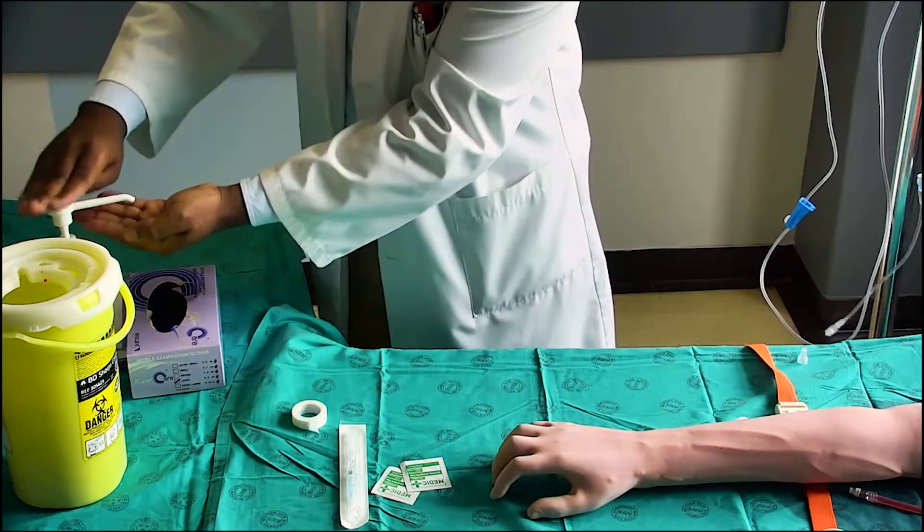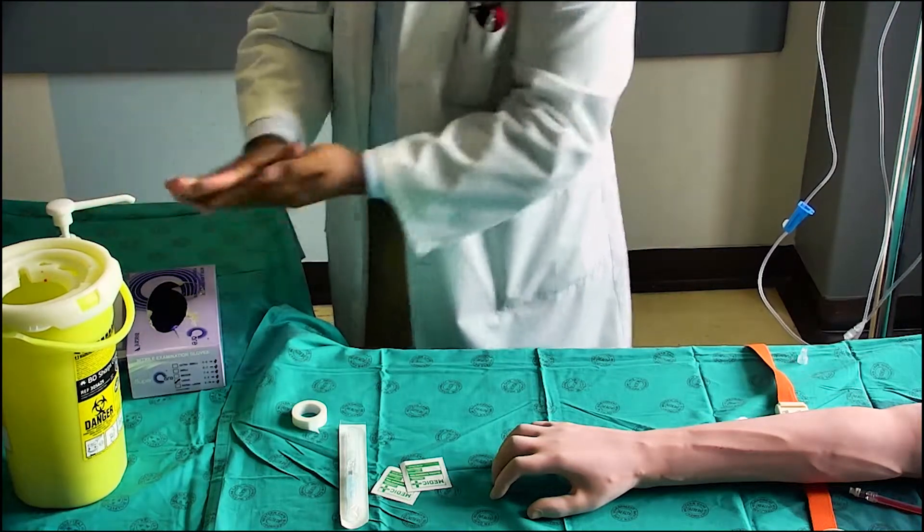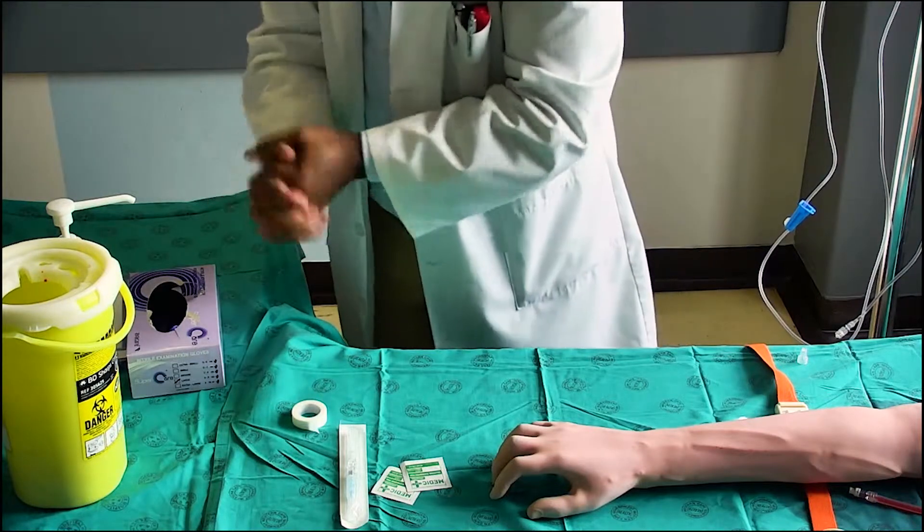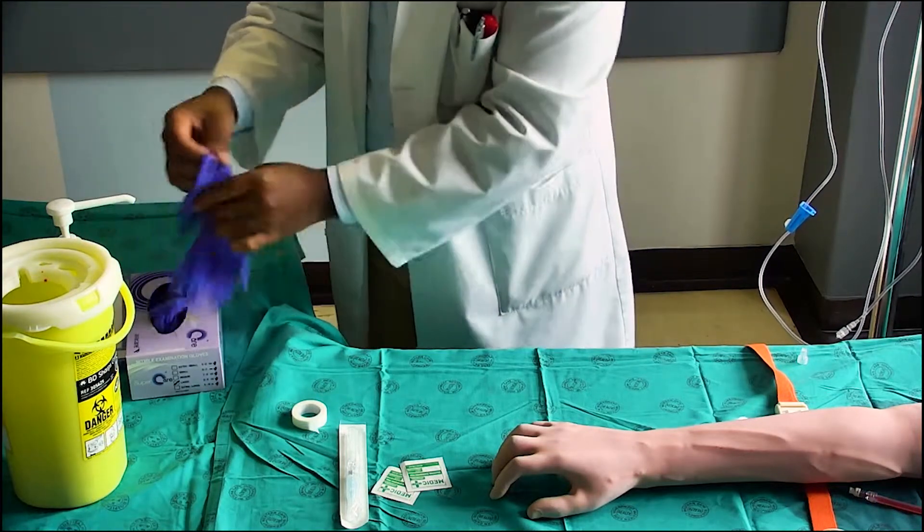Disinfect your hands. Put on non-sterile gloves.